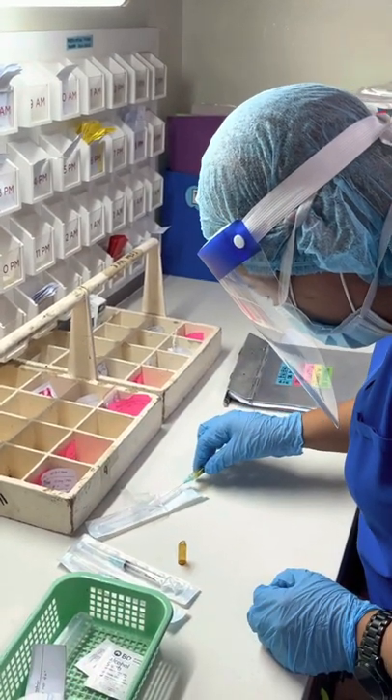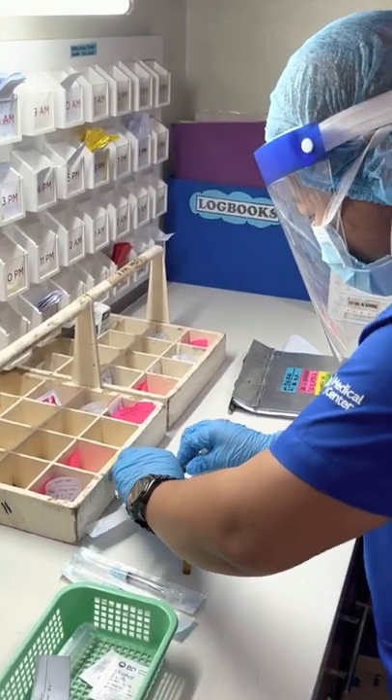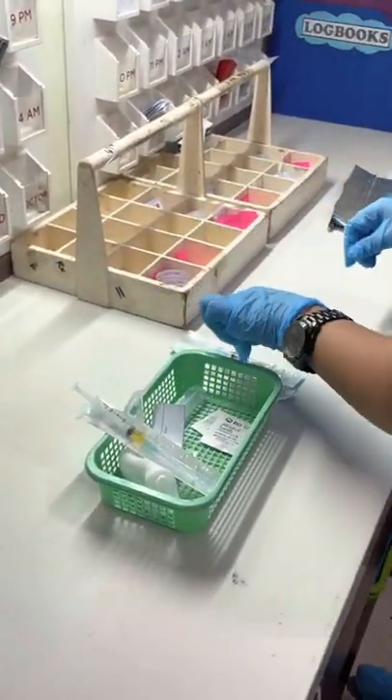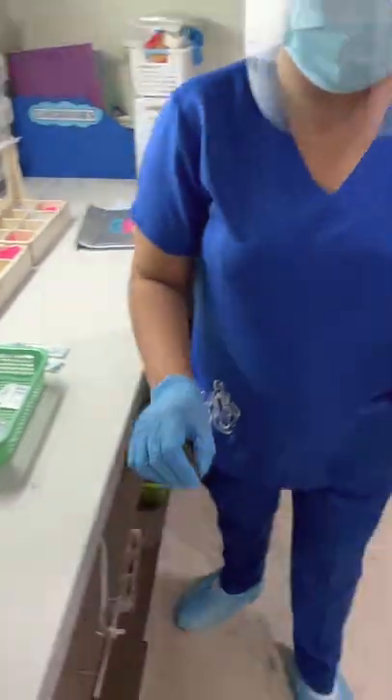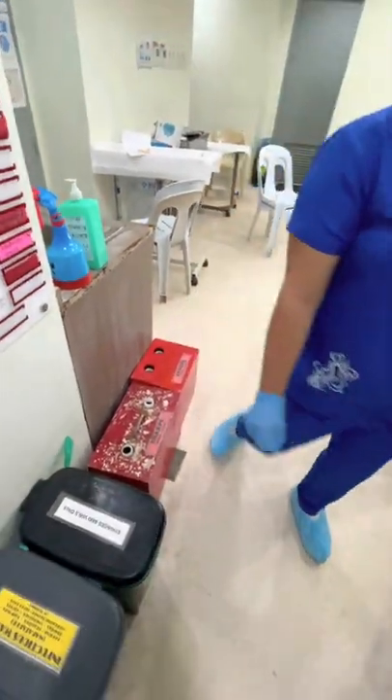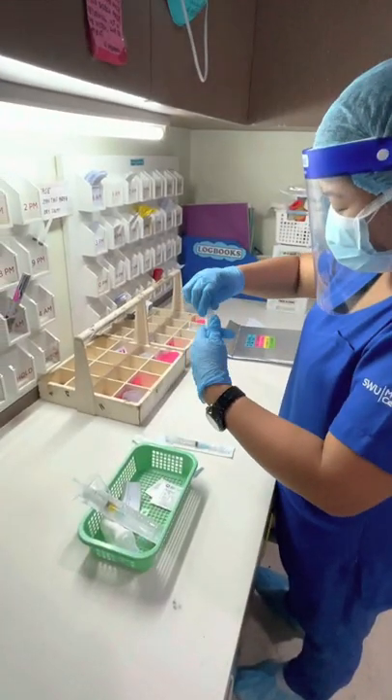Once done, recap the needle using the fishing method. It is very important to do it this way to avoid needle stick injury. Set it aside and put it inside the basket. Do not forget to discard the ampoule in the sharp container after you have finished preparing the medication in the syringe.